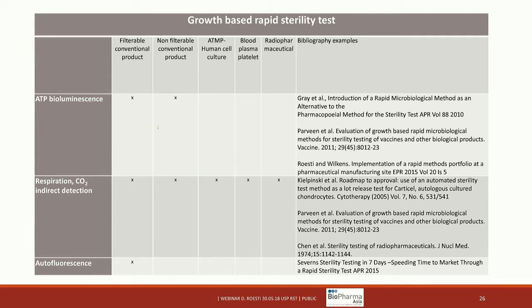And interestingly also, the respiration-based system, so CO2 detection system, can also detect the whole spectrum of products like the conventional, filterable, non-filterable products, the cell therapy, blood plasmas, and also even some radiopharmaceuticals in some cases. So ATP bioluminescence, I will not talk about in detail, so Erin will present a system based on ATP bioluminescence after my talk.